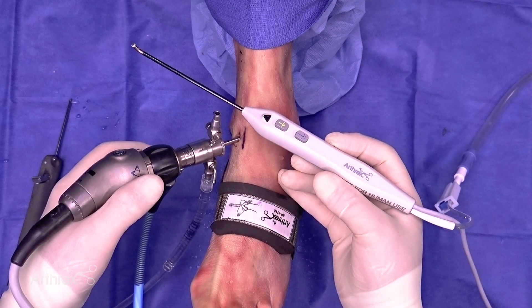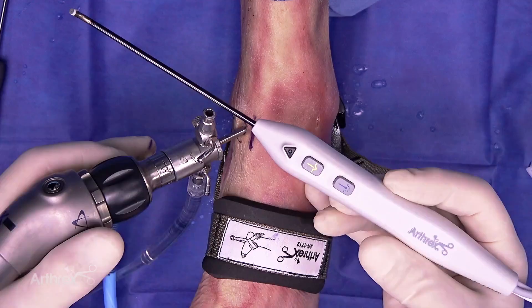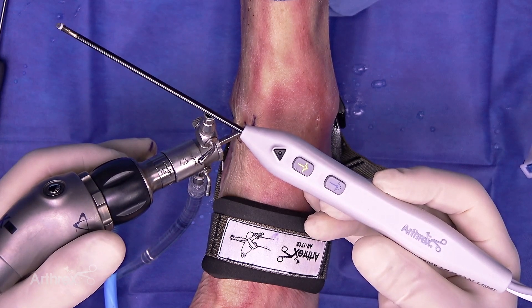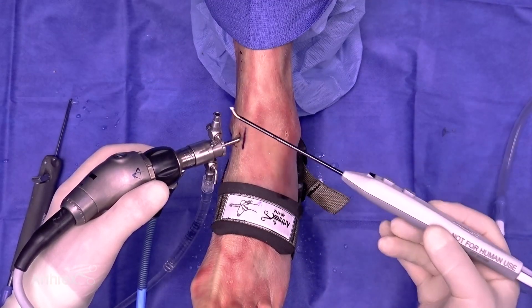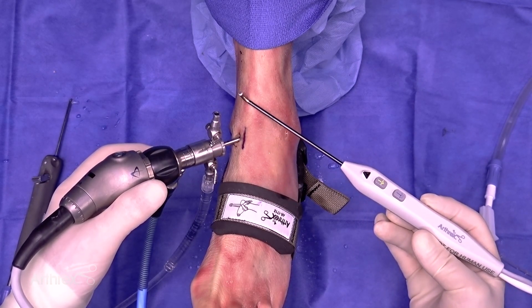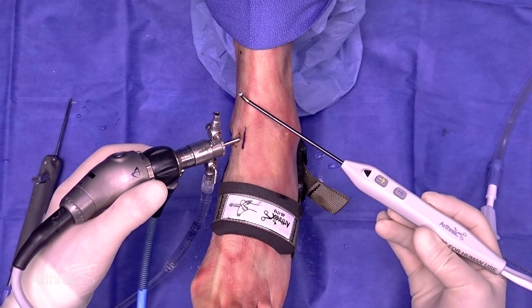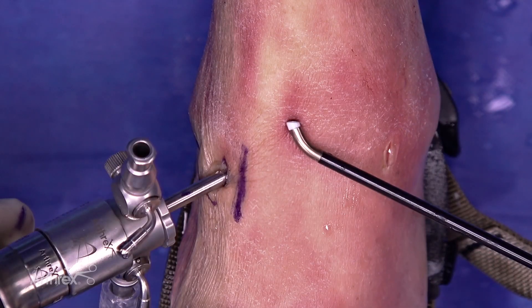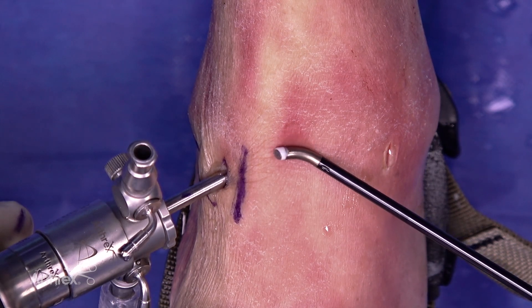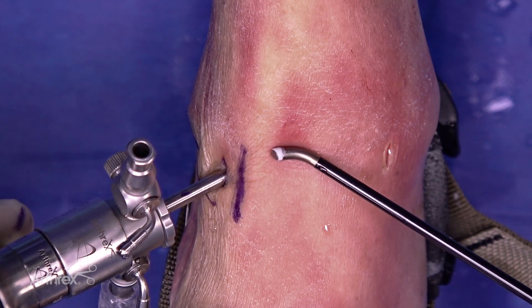It also has hand control, so you'll have blue, which is your coagulation — just like on most instruments — and you're going to have yellow, which is your cut and rapid cut. It comes with factory settings, and 98% of the time the factory settings are more than enough to accomplish everything I need to do. But the nice thing is you can actually increase or decrease the intensities from the factory setting on the probes.